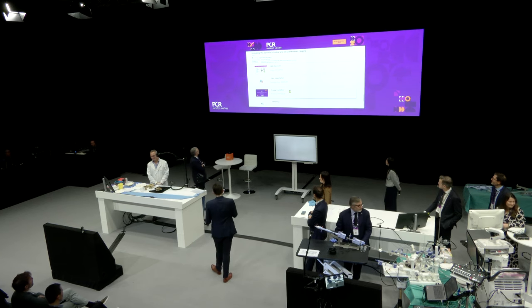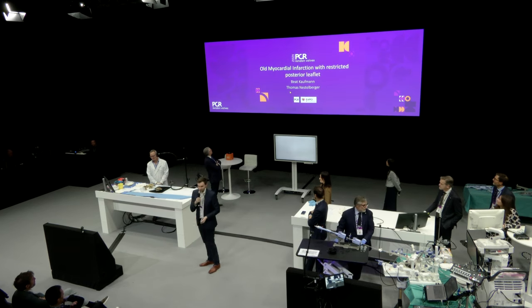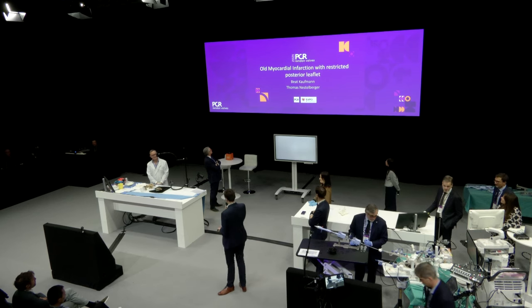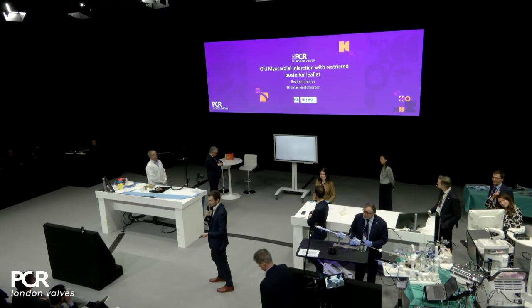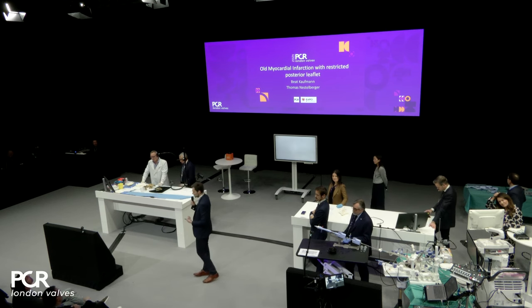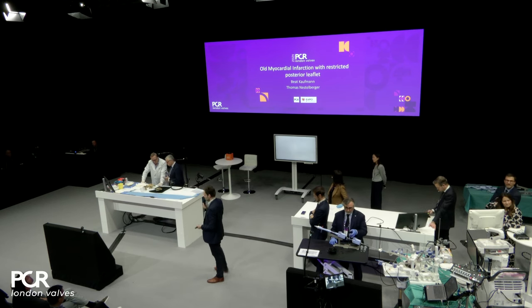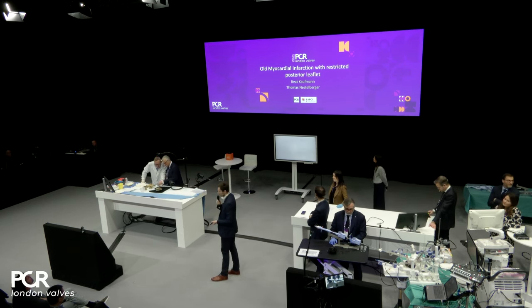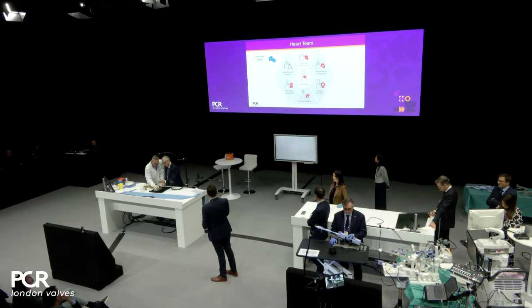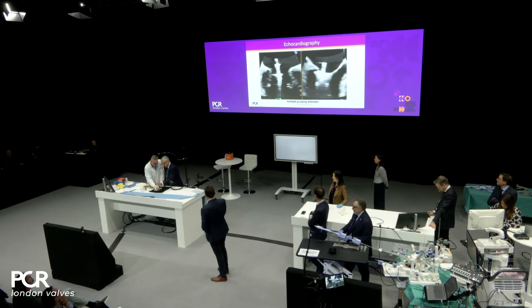Yeah, so we discussed our patient in our heart team and we decided to go for edge-to-edge repair because our patient was very frail. You remember the EuroSCORE was 18% and the patient was very symptomatic, and despite optimal medical therapy, he was still symptomatic and we could not increase his medication. So that's why we decided to go for edge-to-edge repair and avoid surgery or TMVR.